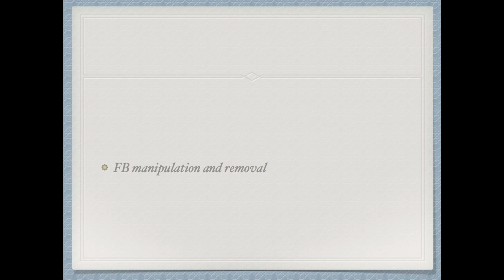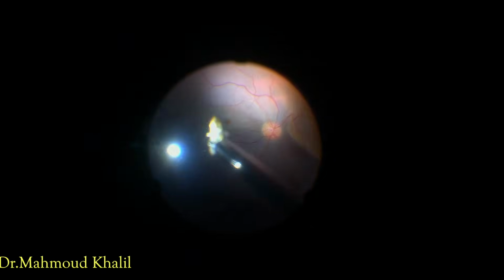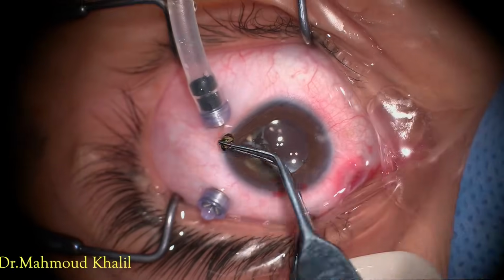Then the most important topic is foreign body manipulation and removal. We will go on a journey through different ways of managing and handling foreign bodies inside the eye. The first case is a young child suffering from retinal detachment with a past history of traumatic cataract surgery. As we see, there is an encapsulated foreign body. Removing the capsule, putting a viscoelastic, and then going with a basket forceps to remove the foreign body. As there is a rim between the IOL and the posterior capsule, we put this foreign body in between and then open the AC and remove the foreign body.